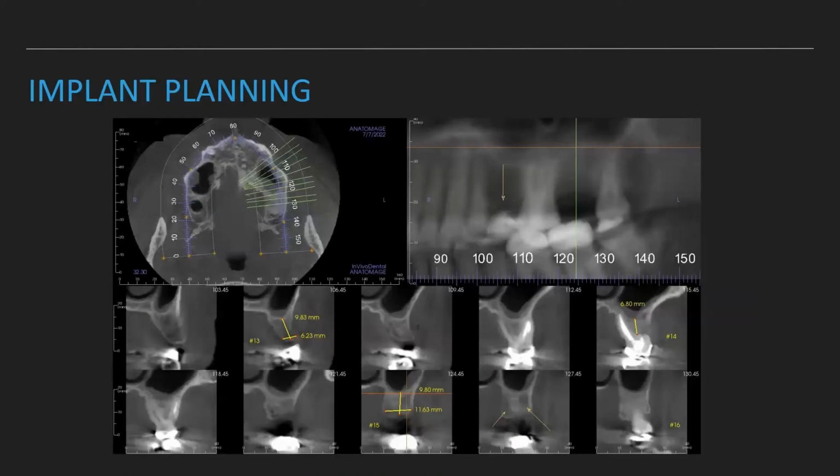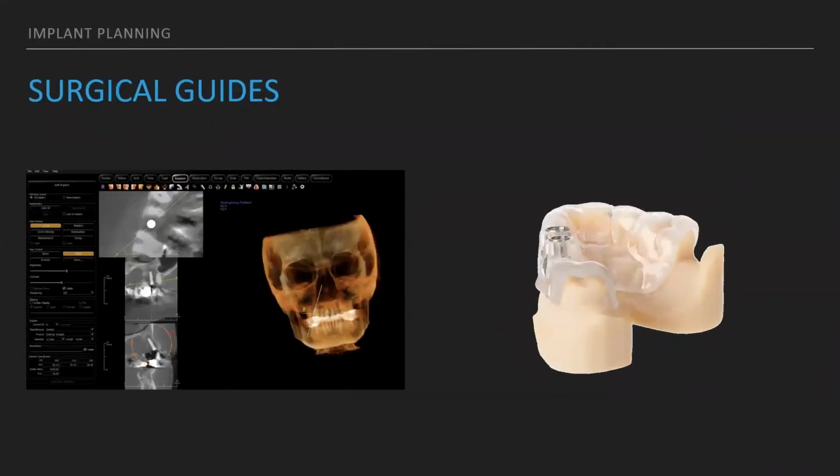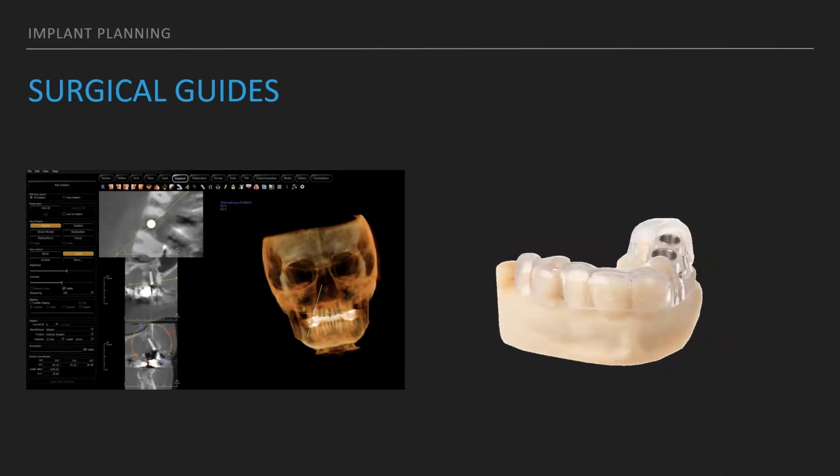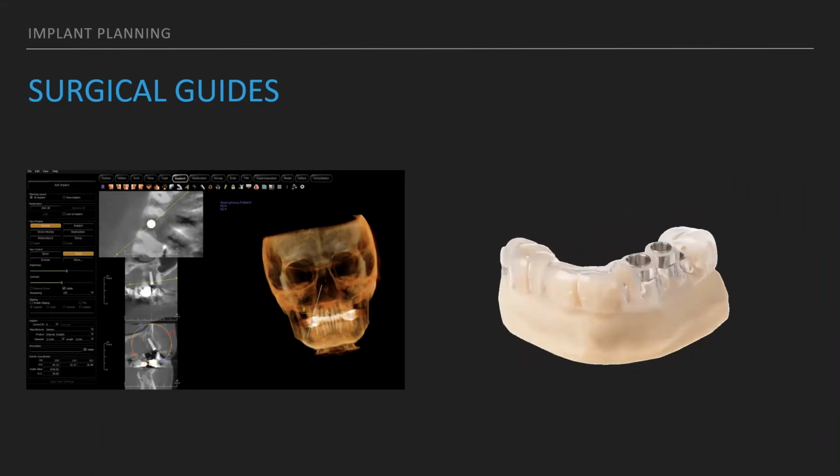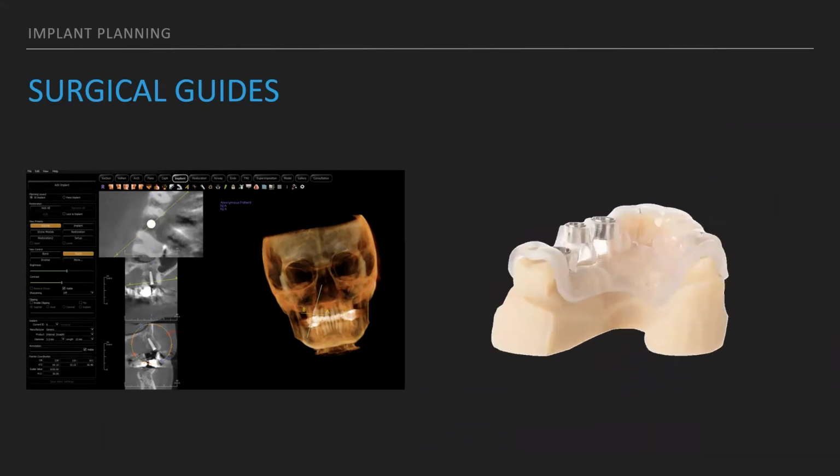So radiology wise, what we would do is usually send out these types of images for any implant planning, giving some nice measurements so that you at least get a ballpark. We still tell the clinician, obviously, when you start planning it yourself and placing these implants, to please be aware that the type of slice we give you could be a little different than what you're looking at. So these measures are really just a good ballpark of what you could probably play with. And then once you are actually defining it, in this tab here in the implant area, that's where you're able to really check the measurements. And again, this is why we push hard for surgical guides so that it's nice, clean treatment planned.